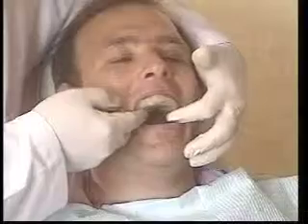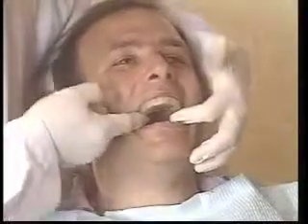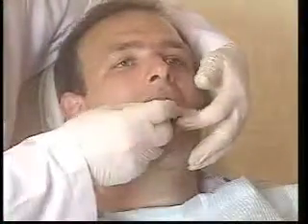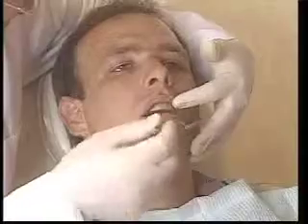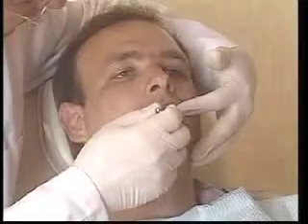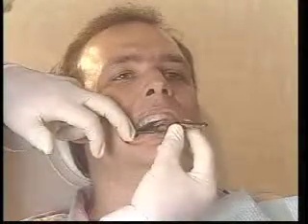Place the upper portion of the silencer. Check for fit. Place the lower portion. Check for fit. Check the bite for balance. Check with articulating paper to make sure there is good solid contact on both bite pads.